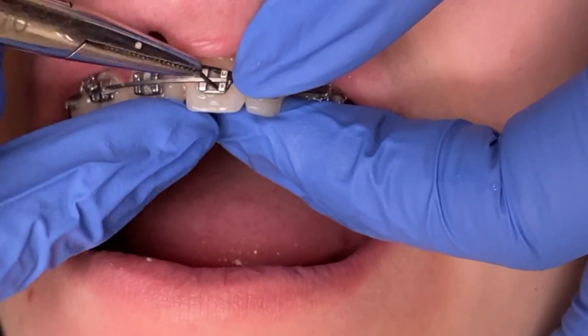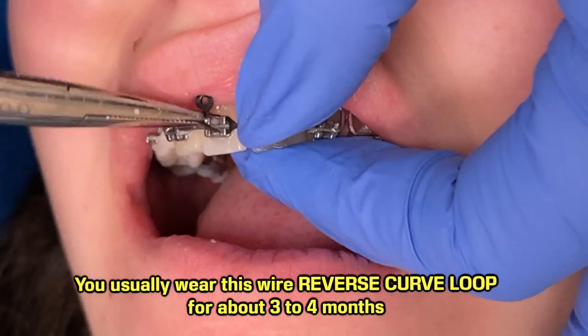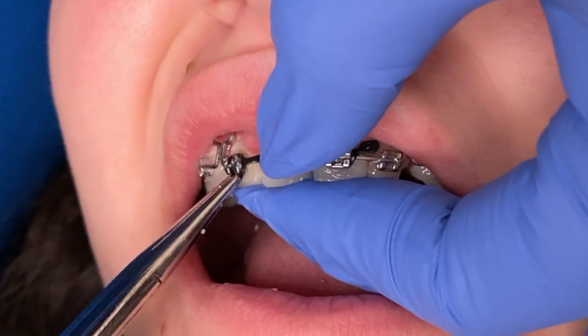With the T-loop, usually they're in them for about 3 to 4 months, depending on how fast the space closes, how good they're wearing their rubber bands.